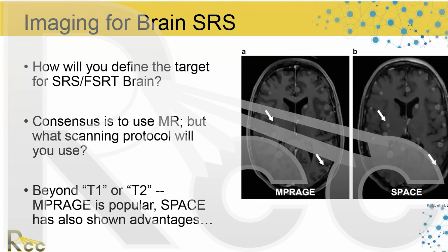Thank you. And I will just make a quick comment. I'm not sure if all MP sequences are 1 millimeter thick, but all the ones I've seen at least were. Oh yeah, that's a good comment, and we're actually going to touch base on that too. That's why in the last discussion we talked about interfacing with outside groups, whether that's IT or referring physicians. It's also radiology, because radiation oncology and radiology are sometimes separate groups. So if you're going to be using an MP-RAGE for your stereotactic program, ideally you're going to interface with those MR technologists to develop that protocol so it's appropriate for you.